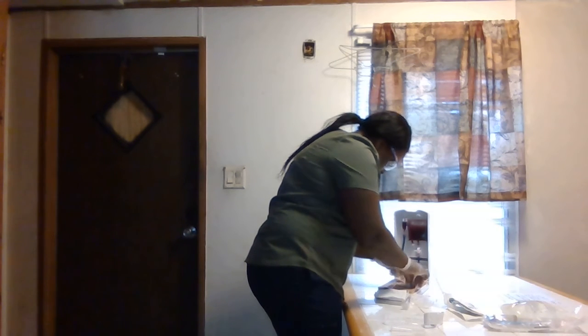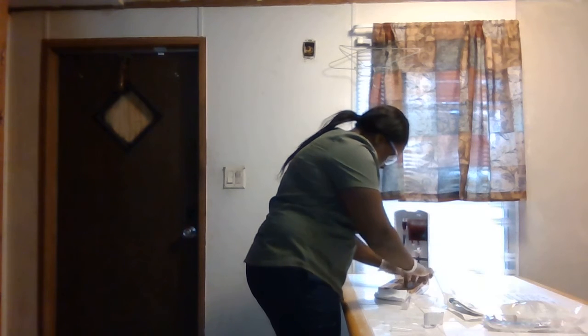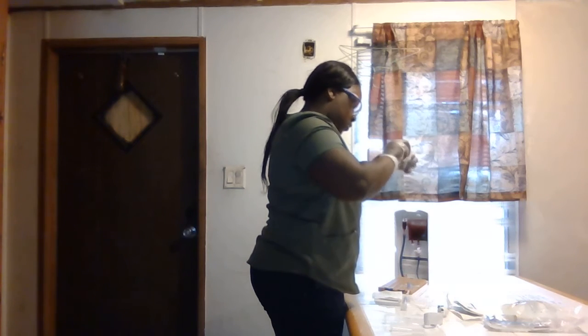Peeling, just walking the tape off. Here's my label. Taking my tape, securing it with my tape. Gloves won't do it right. And then I'm going to tear it in half, and we're going to chevron it.